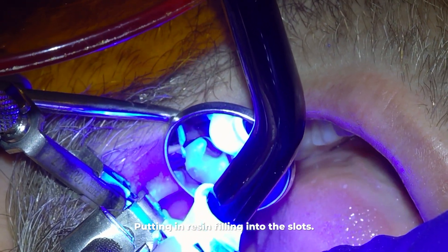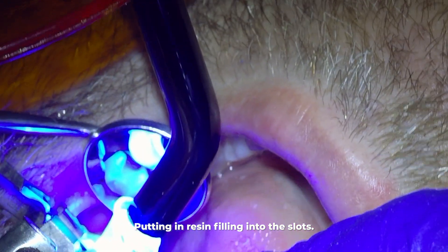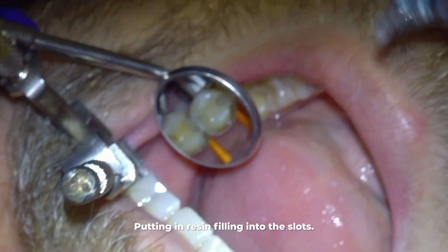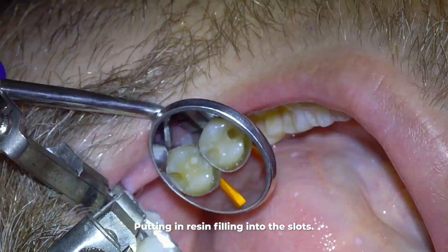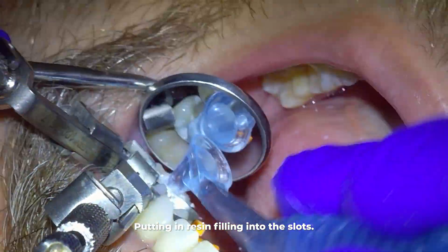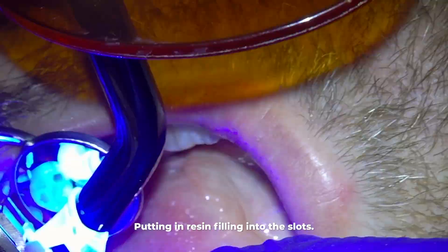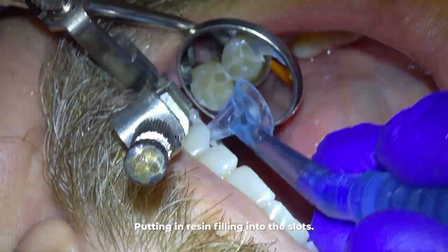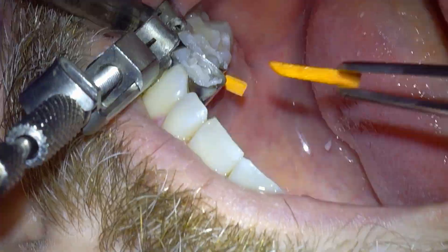When the filling shrinks it can't shrink inward with the blue instrument in place, which reduces the possibility of sensitivity and micro leakage. This also pushes the filling up tightly against the adjacent tooth — creating a very tight contact like the wedge was also meant to do — and that tight contact prevents food impaction.